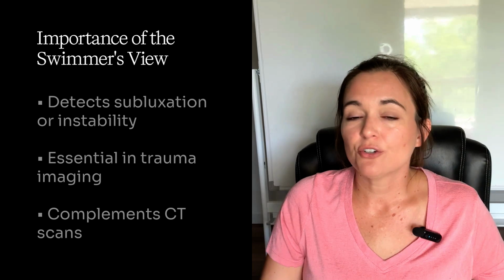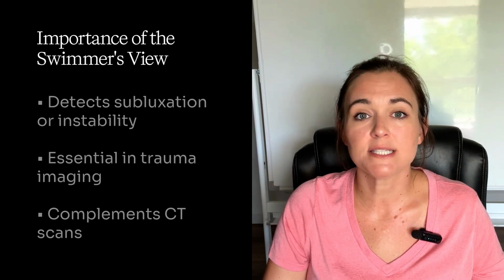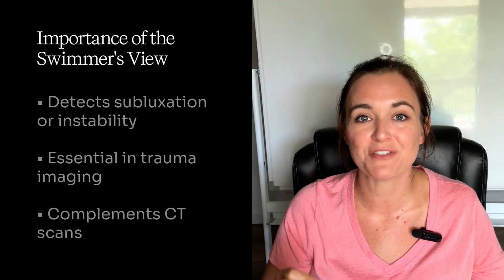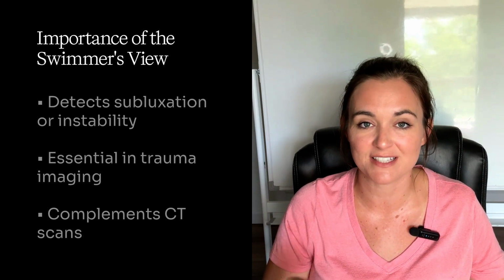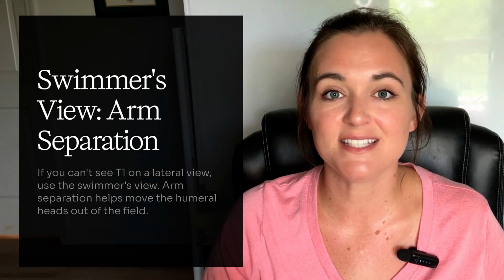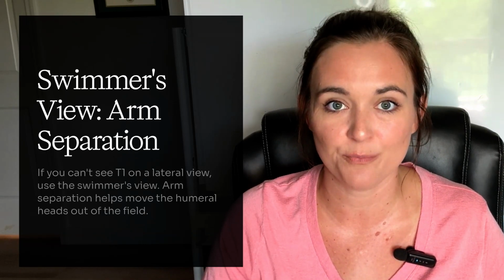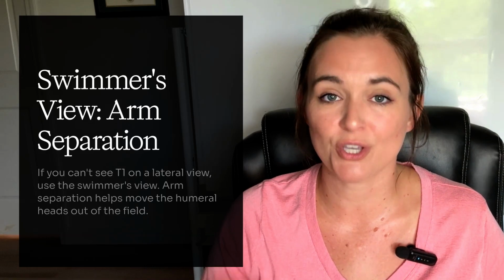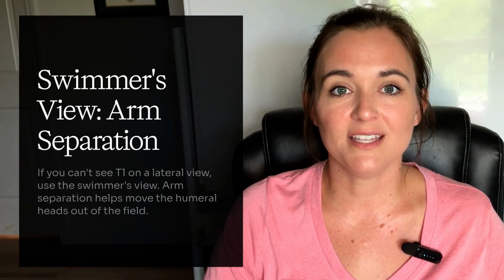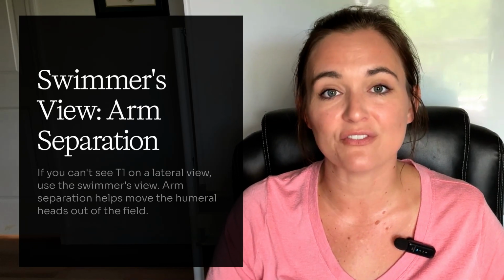This view is critical in trauma. You might miss a small subluxation or instability right at C7-T1, especially if the patient's arms are down during the scan. ARRT style hint: if you can't see T1 on a standard lateral C-spine or T-spine view, the swimmer's view is your go-to. If the test asks what makes the swimmer's work, the answer is arm separation to move the humeral heads out of the field.